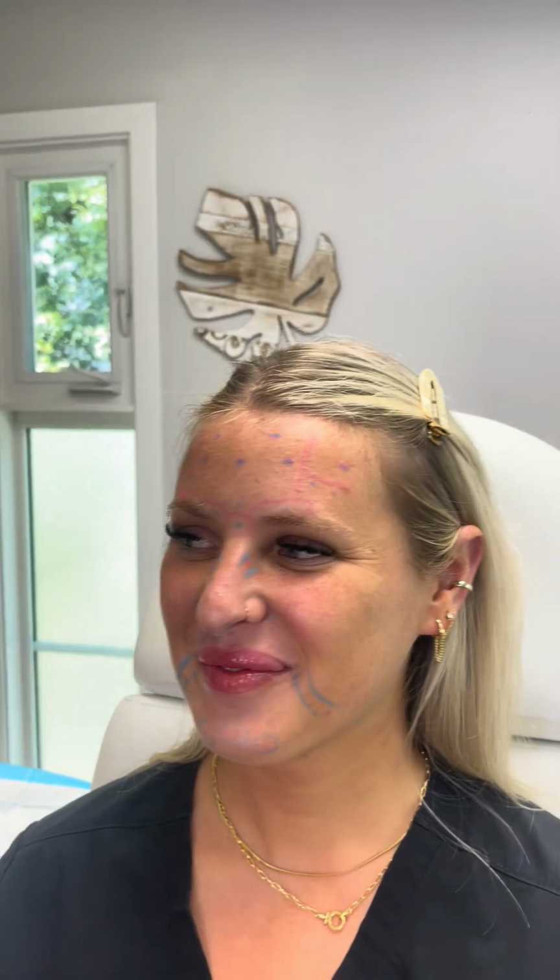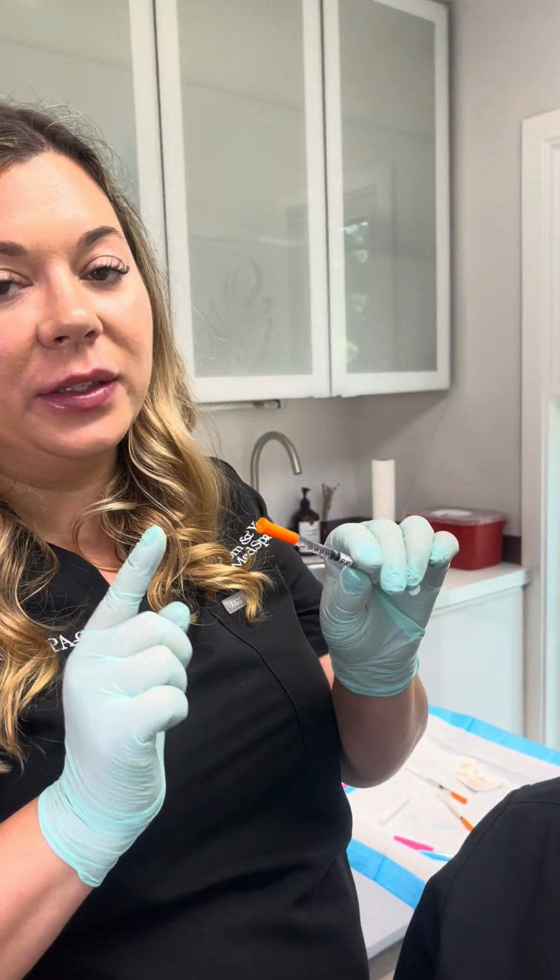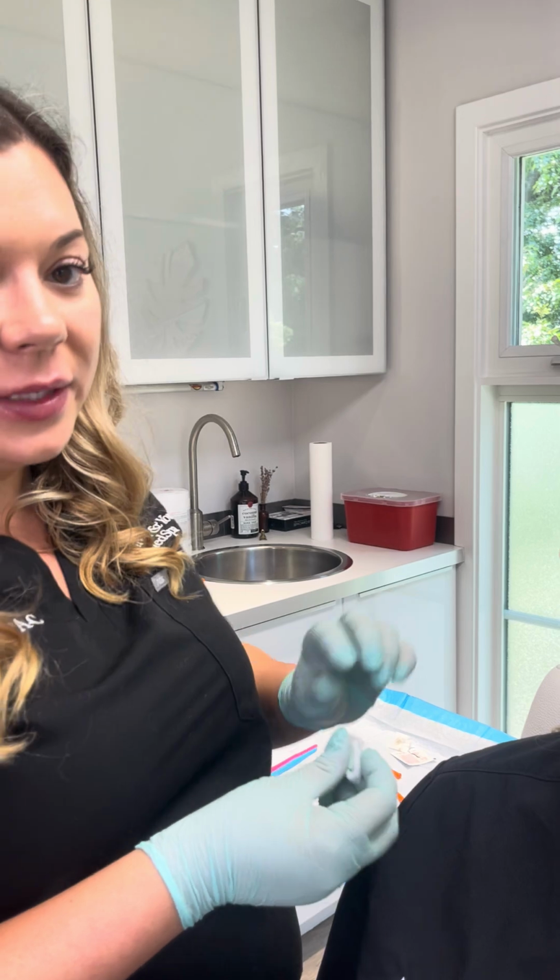With the masseters too, when I go to the other side, I already have the dosage drawn up, but I like to use a separate syringe because it's a separate needle. So remember, every time you stick somebody, the needle is going to dull, and that's going to cause more and more discomfort. And this is especially important when you're doing full face toxin or even filler.